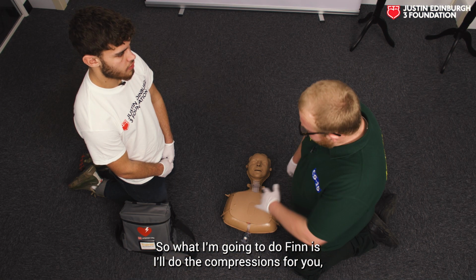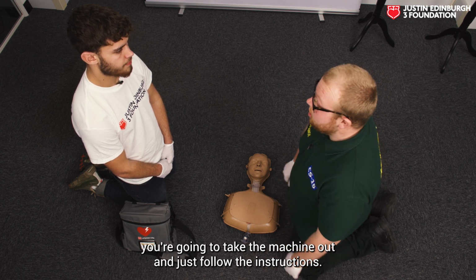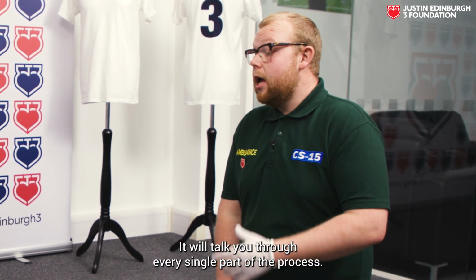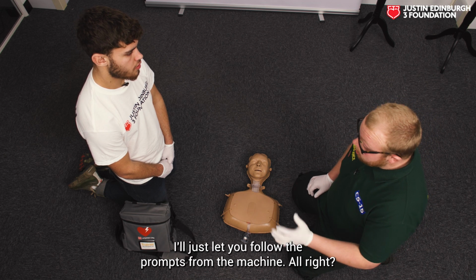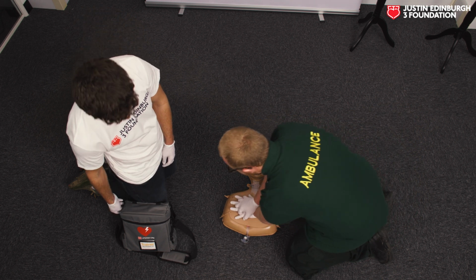So what I'm going to do, Finn, is I'll do the compressions for you. You're going to just take the machine out and just follow the instructions. The machine cannot do any wrong. It'll only shock the patient that needs a shock. It will talk you through every single part of the process. So I won't really talk throughout this, I'll just let you follow the prompts from the machine. All right? Yeah. Right, start when you're ready.